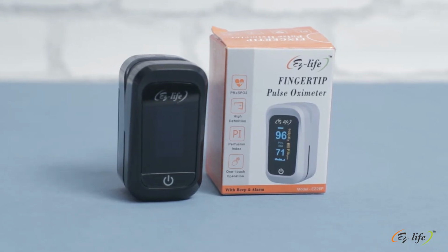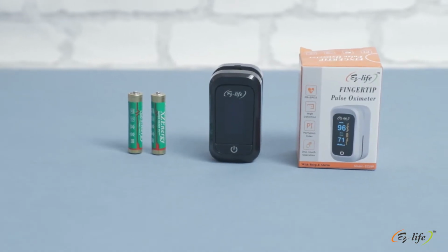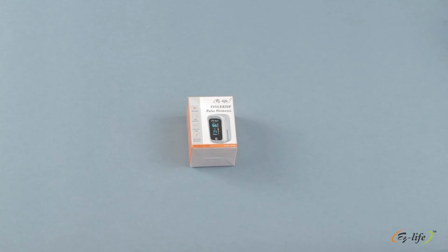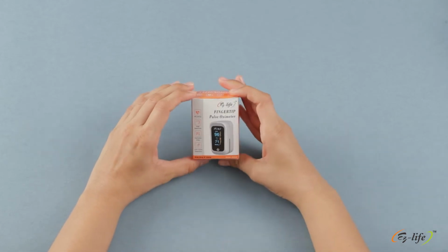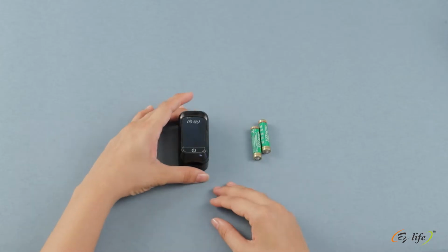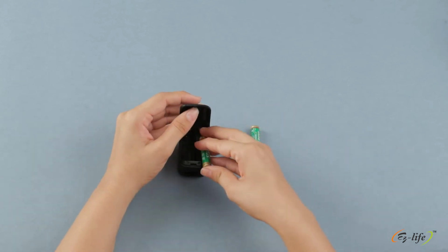Today we will learn how to use Easy Life Pulse Oximeter. In a box, you will find your pulse oximeter device and two AAA batteries. Easy Life Oximeter will help you in measuring your blood oxygen and pulse rate mainly. After taking device out, please insert both batteries into the device.